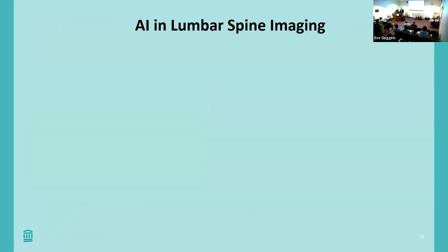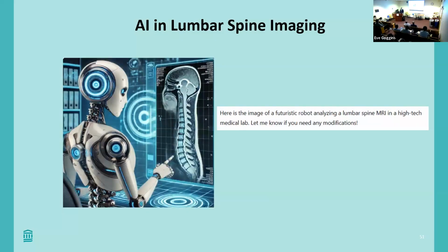Okay, so now a couple words on AI and lumbar spine imaging, because there's a lot of really interesting work here. And I think AI is going to really be our helper in this area. Again, I asked ChatGPT, can you make a picture of a robot analyzing a lumbar spine MR? Here is the image of a futuristic robot analyzing a lumbar spine MR in a high-tech medical lab. Let me know if you need any modifications. Well, let's just zoom up on the lumbar spine here.